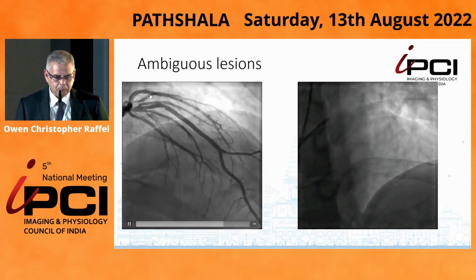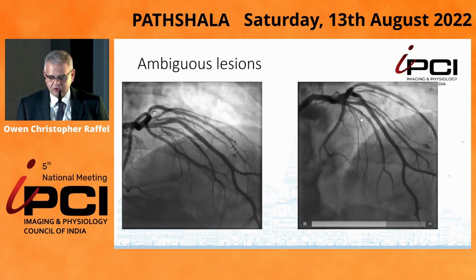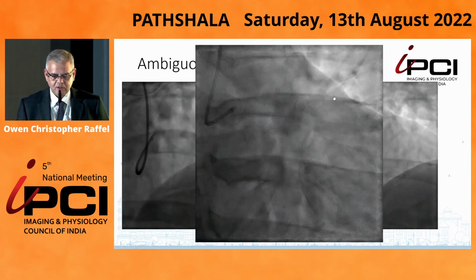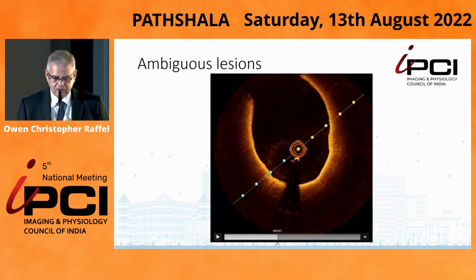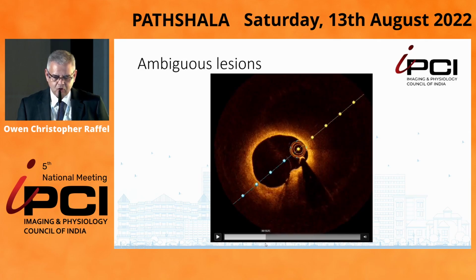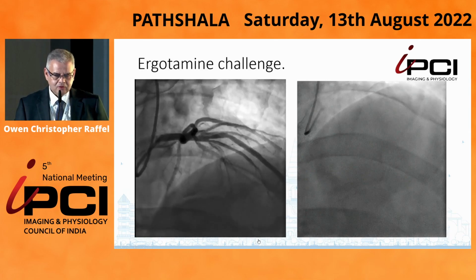There's something here in the proximal LAD, which is a little bit difficult to see, but certainly some tapering there, so we did an OCT, and that's our OCT. You can see there's a little bit of irregularity there with plaque, but absolutely no thrombus there at all. So there's proximal LAD plaque, no clear disruption with thrombus to explain an NSTEMI. So this is what we did.